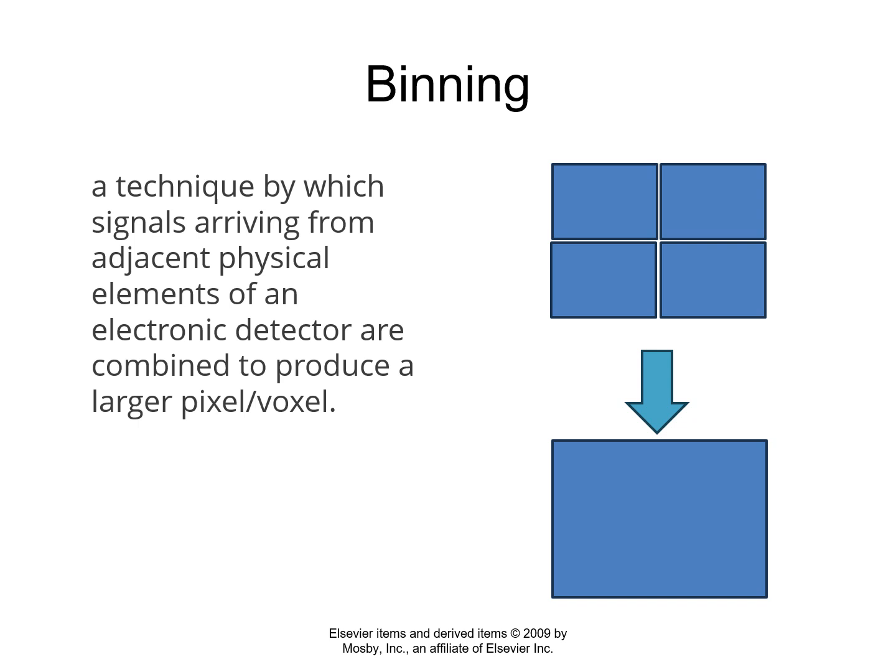And so this is 1 frame out of 30 that you're going to see in a second. It is going to look just a little bit fuzzier, but it's going to look like fluid motion because we can increase the frame rate with binning. There is some more fuzziness to the edge and a loss of spatial resolution, but the images are going by so fast that you don't really notice its impact.